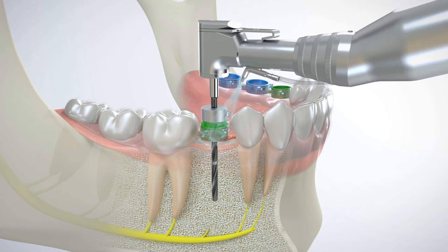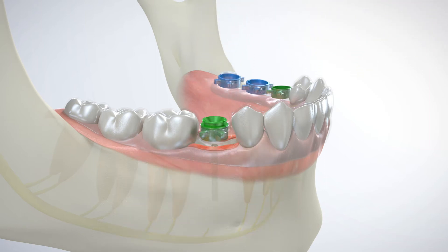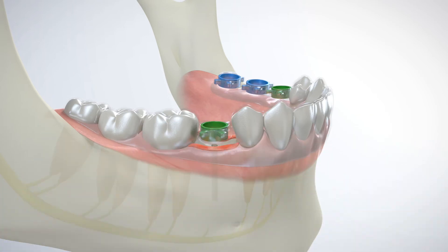GRS drill stops ensure safe, precise osteotomy depth by reliably limiting surgical drill penetration to a pre-measured depth. The IR tool firmly engages the drill sleeve using a sliding motion and is then removed together in a vertical motion. A GRS surgical drill sleeve matching the diameter of the next surgical drill is removed from the cassette using the GRS IR tool.